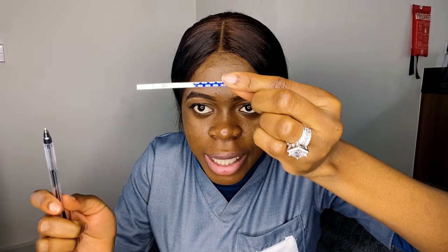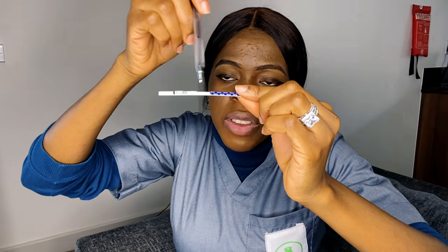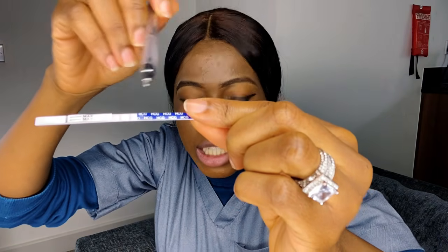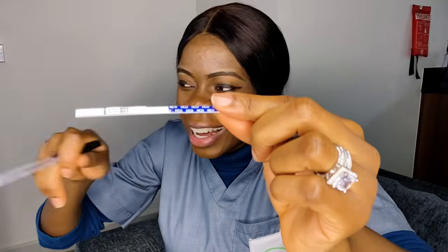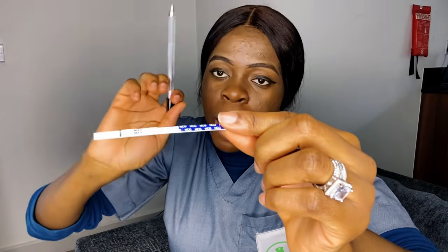Are you seeing the 2 lines? You can see there are 2 lines here. This is not the max line. There are 2 lines here. So if there are 2 lines, it simply shows that you are pregnant. I just wish you can see the 2 lines. Yep, you can see those 2 lines there. It shows that this particular person is pregnant and she's going to start buying baby things. So when you see 2 lines there, it simply means you are pregnant.